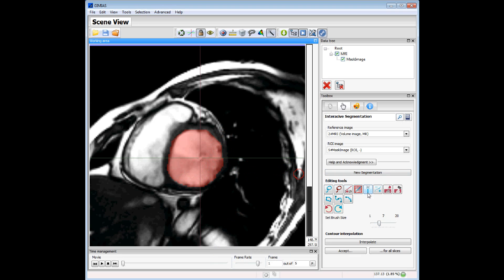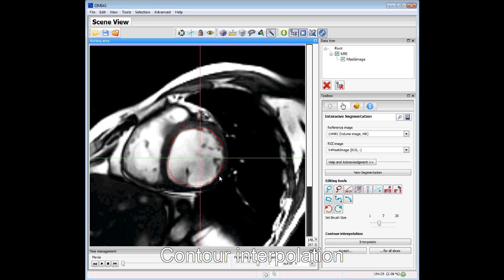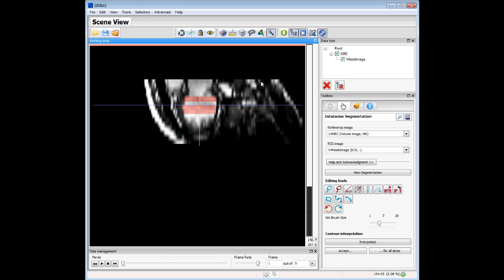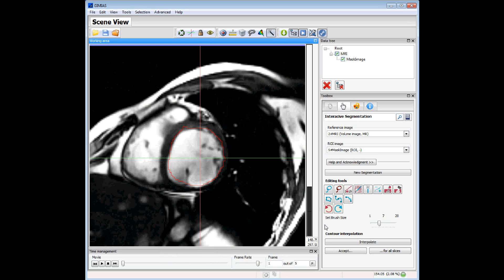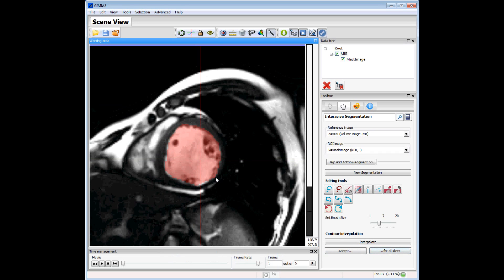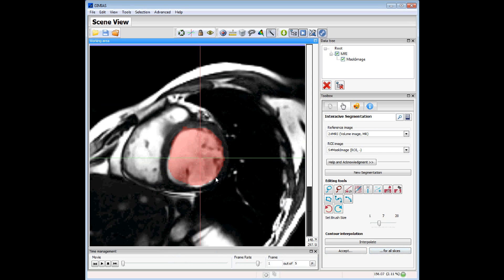We can also use the contour interpolation feature. Moving back to the other slices, we can see the red line — this is the interpolated contour between the first slice segmented and the second one. If we are satisfied with this interpolation, we can click the button to apply it to all slices, so all slices between the first and last segmentation are filled in. This is the contour segmentation feature.